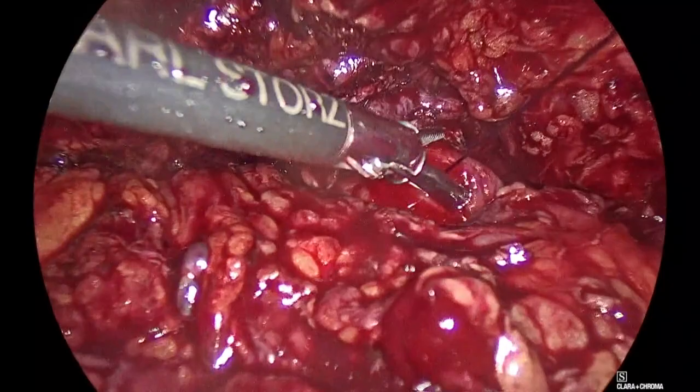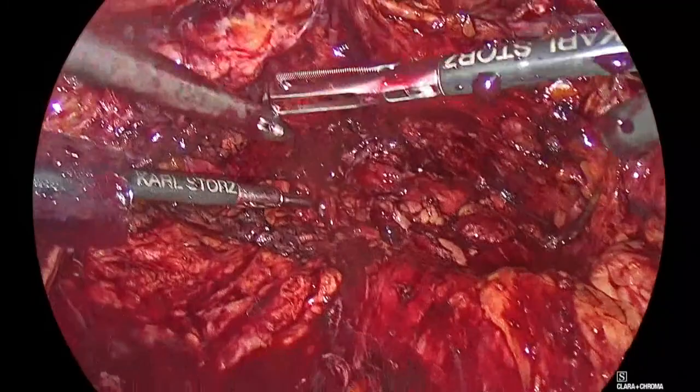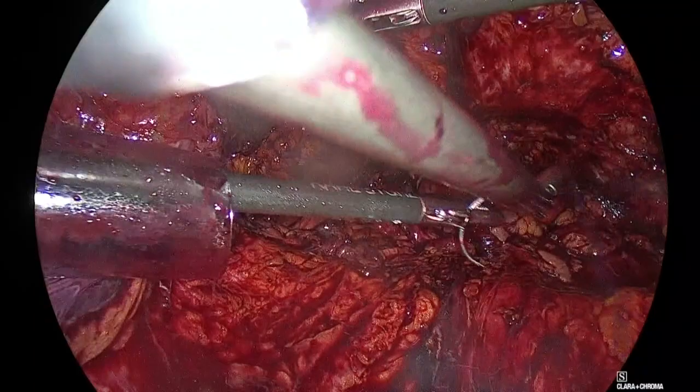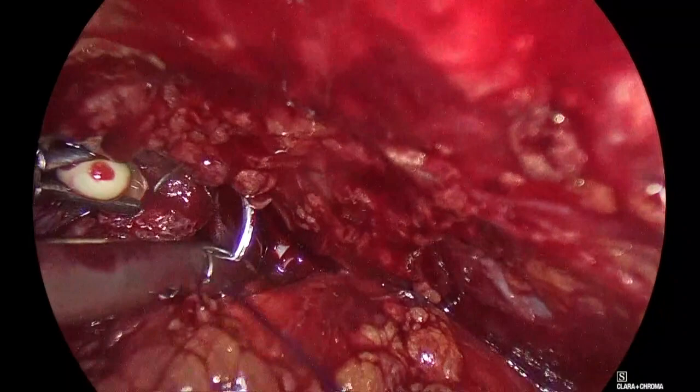Okay, go back. Wait, keep this suture straight. There, keep it straight. Good. Panagiotis, go on top of me. See, it's a coordination game also for the anastomosis. Needle. Good. I moved from the interrupted to the continuous suture after robotic experience. So come in. Good. So I think that it really works out very nicely.